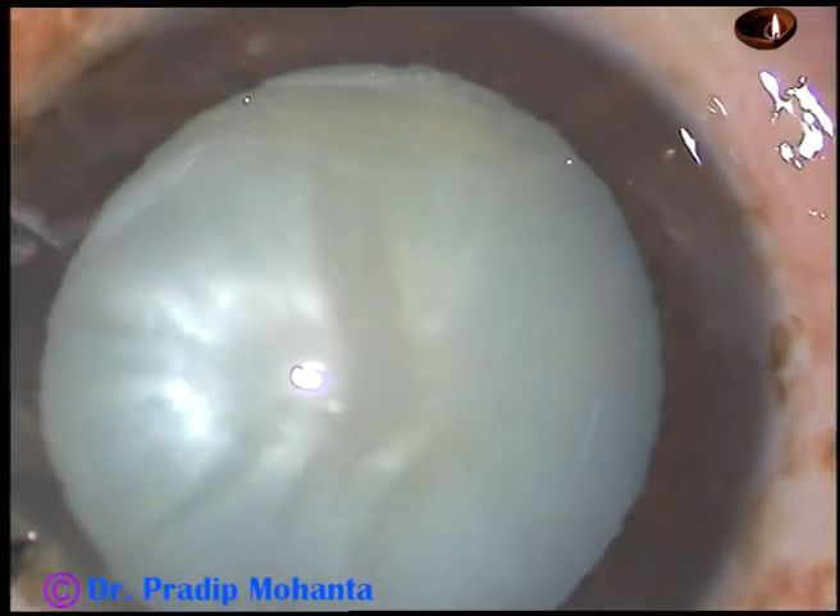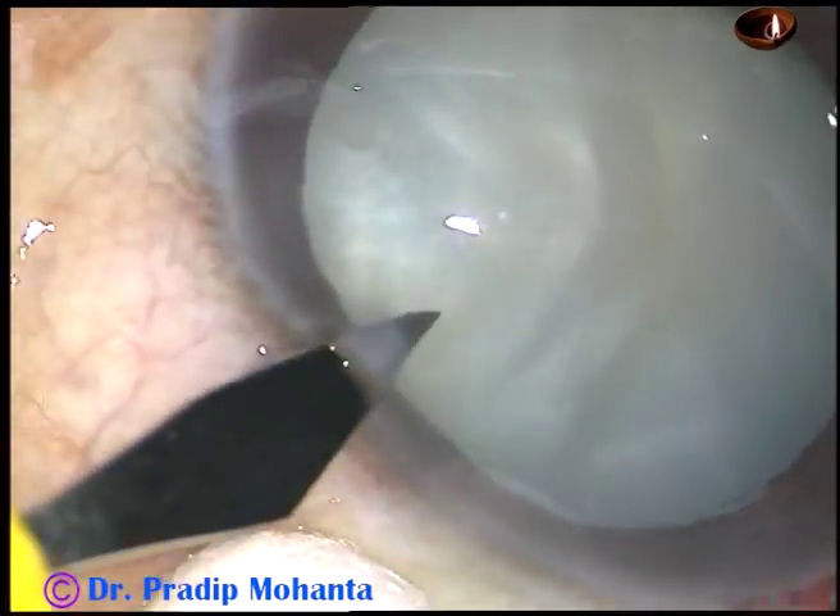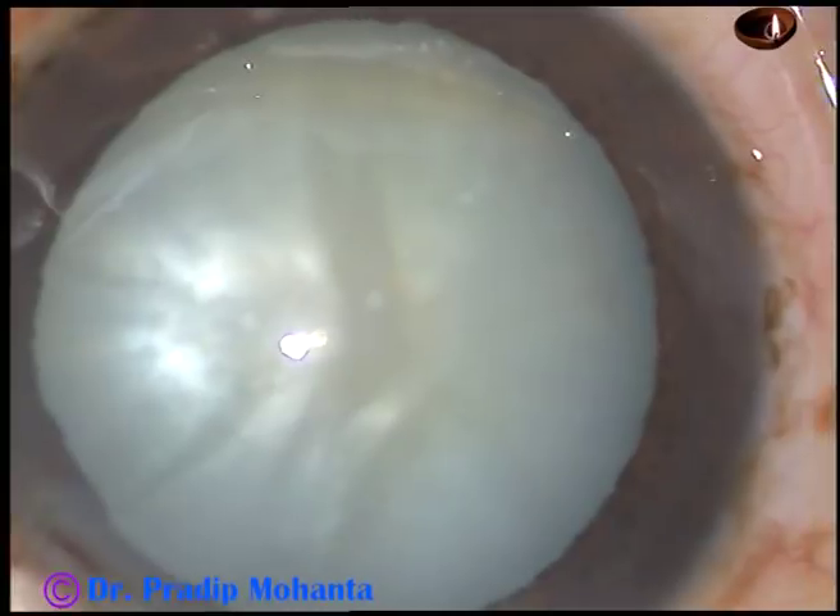And this is another paracentesis, 2.5 clock hours away on the left side.